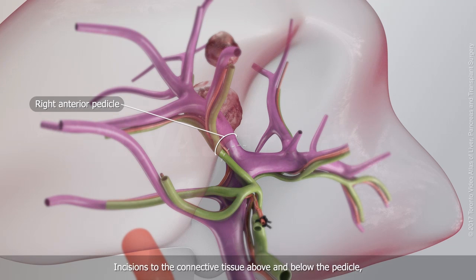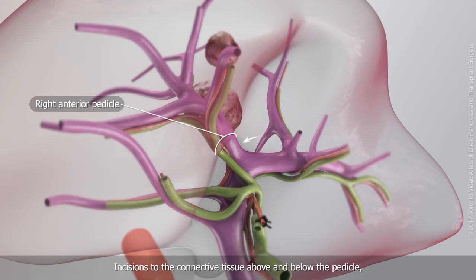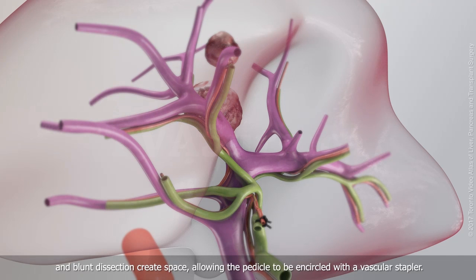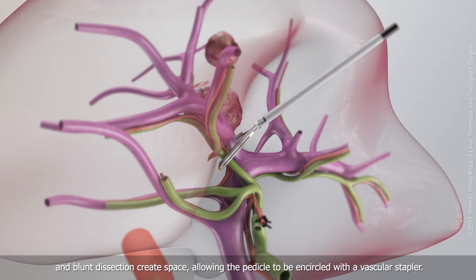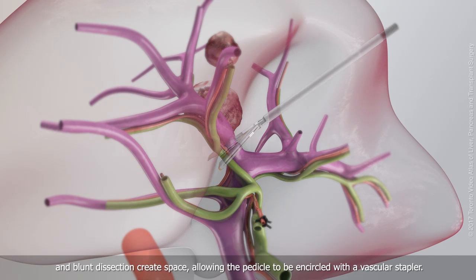Incisions to the connective tissue above and below the pedicle, and blunt dissection creates space, allowing the pedicle to be encircled with a vascular stapler.